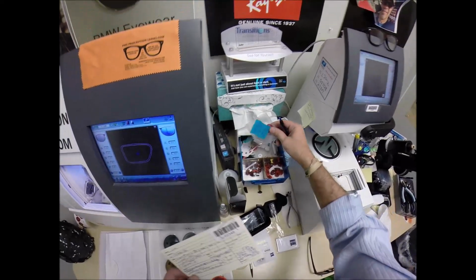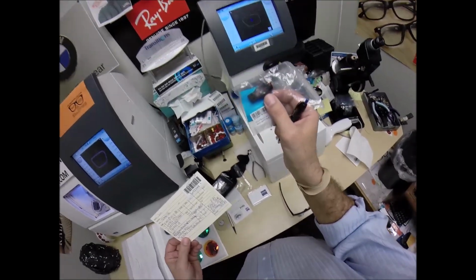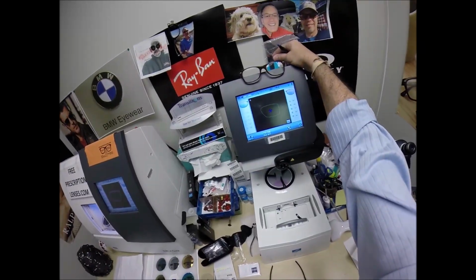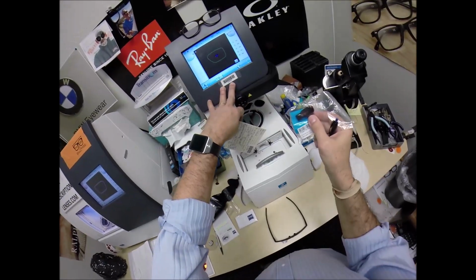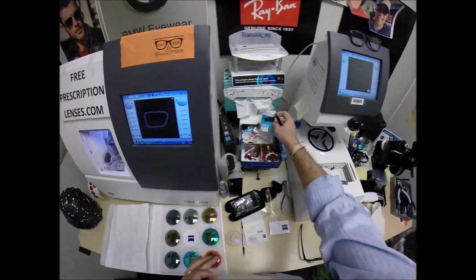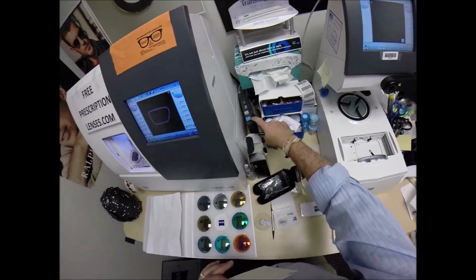I'm sorry, this is a personal note to another optician in Bosnia-Herzegovina. Take a regular jump drive and transfer the data. This sticks in the top, as you know. Transfer when you get to 1,000. When your memory gets full here, transfer it to here, and then delete all that and you'll go back to 0. I highly recommend buying the SE box.